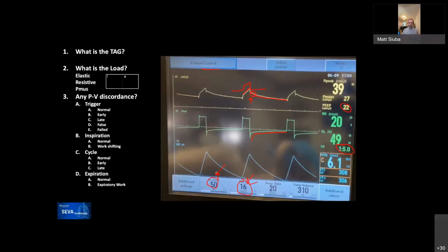The other thing I noticed was the end tidal waveform, which, if you know me, I'm kind of obsessive about end tidal. The end tidal waveform was a perfect peak like this, so the efficiency of CO2 removal was basically nil. We were getting an end tidal number of 40, and on a blood gas the PCO2 was in the mid 70 range. So really discordant there, which tells you that our efficiency of ventilation had essentially gone to almost nothing. And again, it was completely corrected by changing the vent out.